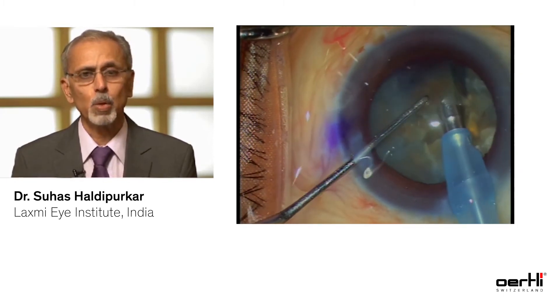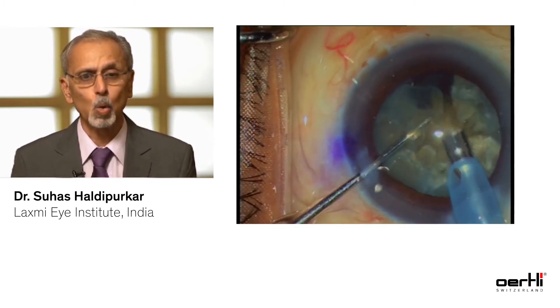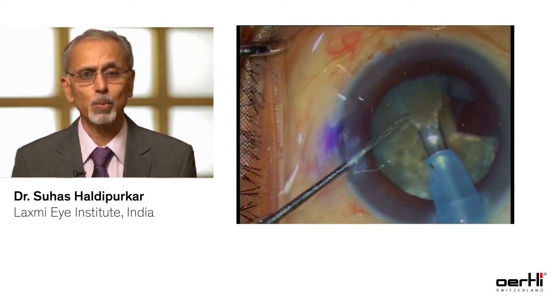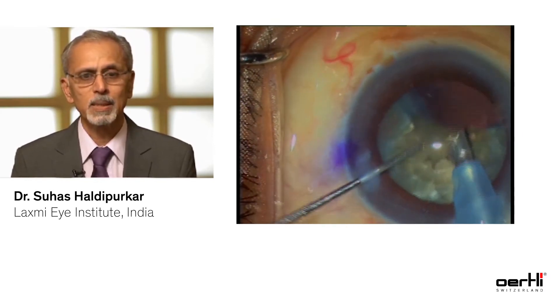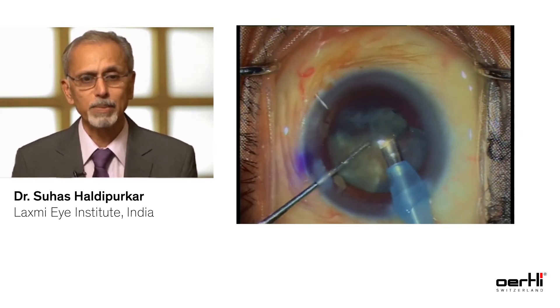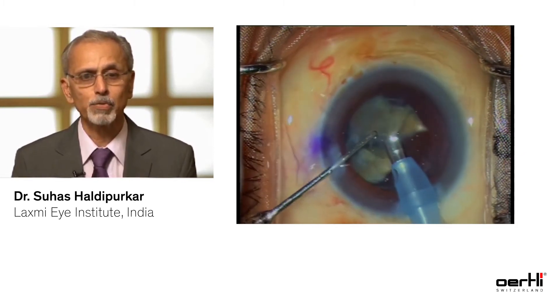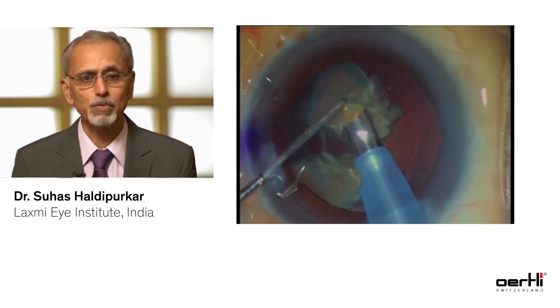Whenever you want to emulsify, your phaco tip has to get occluded, so turn your bevel to the side where you wish to emulsify the nuclear fragments. As you reach the final fragments, it is better to lower your phaco tip parameters at this stage.